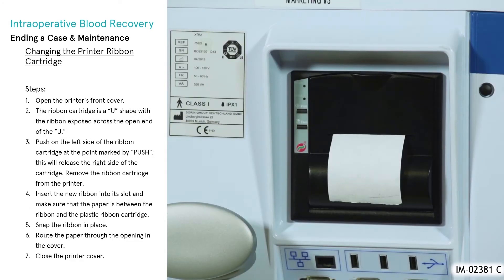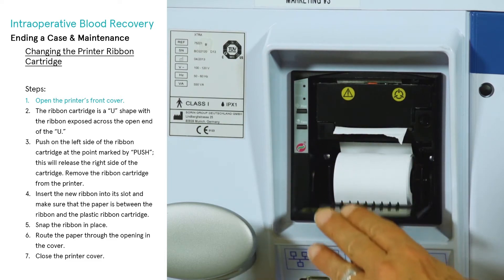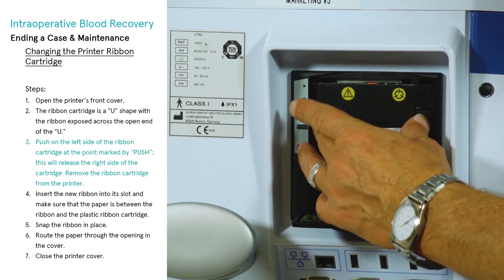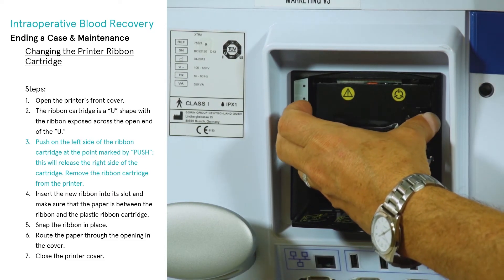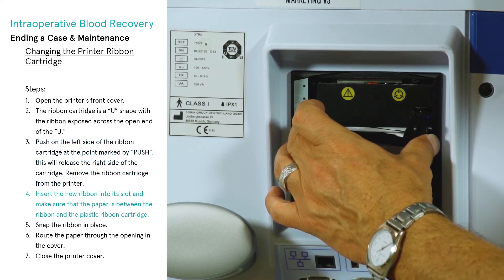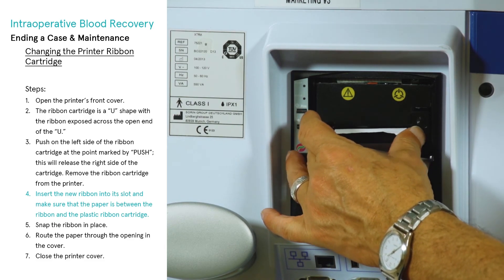Changing the printer ribbon cartridge: when it is time to change the ribbon, the print will begin to lighten. Open the printer's front cover. The ribbon cartridge is U-shaped with a ribbon exposed across the open end of the U. Push on the left side of the ribbon cartridge at the point marked 'push' — this will release the right side of the cartridge. Remove the ribbon cartridge from the printer. Insert the new ribbon into its slot and make sure that the paper is between the ribbon and the plastic ribbon cartridge.